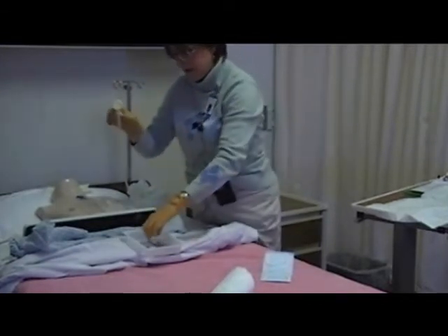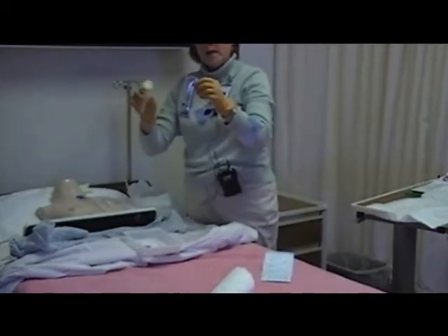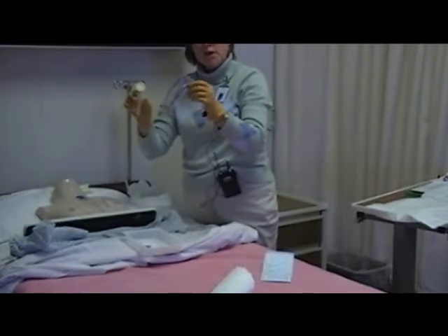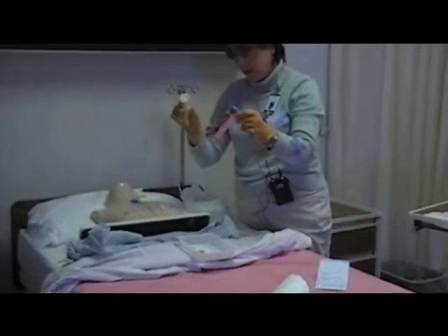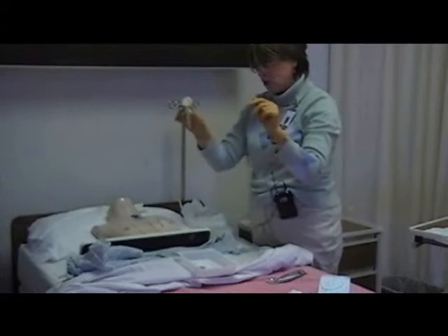Now, in your kit, you will also find an alcohol swab stick. If you find that your patient has a lot of drainage on their skin, you will use the alcohol swab stick first to remove any unusual exudate that's there. Okay? He has no drainage. It looks really good. So I'm going to discard of that. And I'm just going to drop it there.